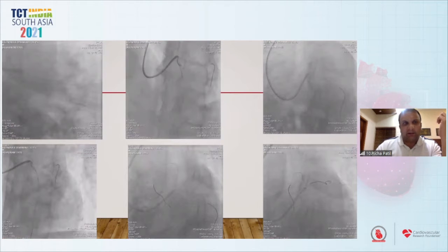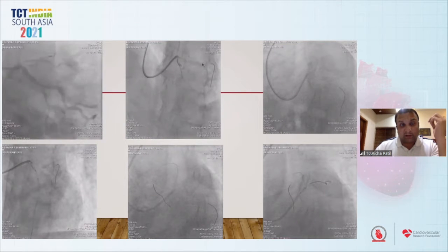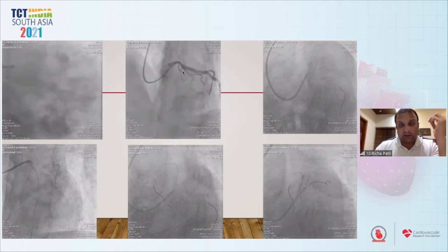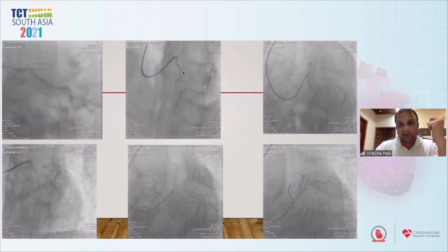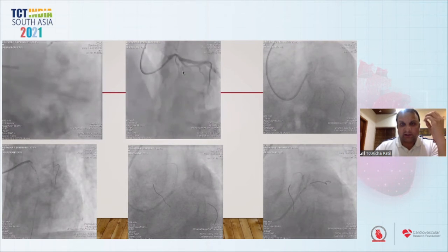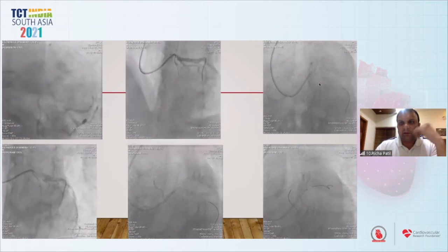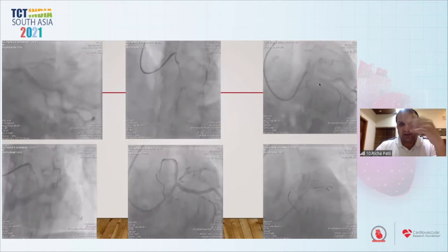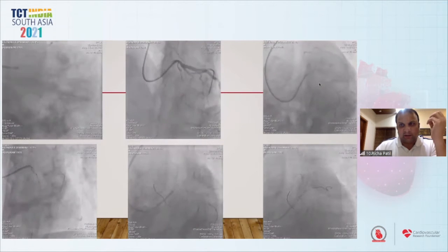Sometimes it presents like calcium in a chronic occluded vessel. There is acute on chronic. As you can see, there was no flow at all into the LAD. There was a total cutoff. There is calcium. There was a chronic lesion, which presented as an acute and chronic coronary lesion here at the ostial LAD. I started using the XTA wire with the microcatheter in this case. I couldn't see further, there was no flow. I could cross with the help of the microcatheter and the XTA wire.